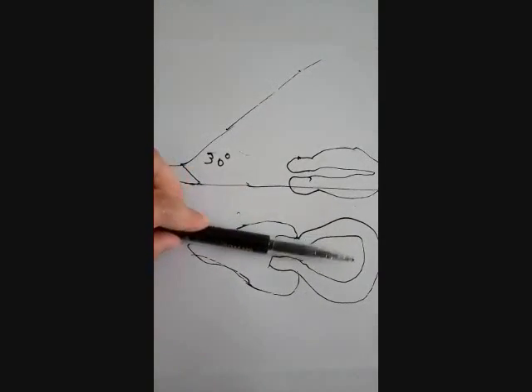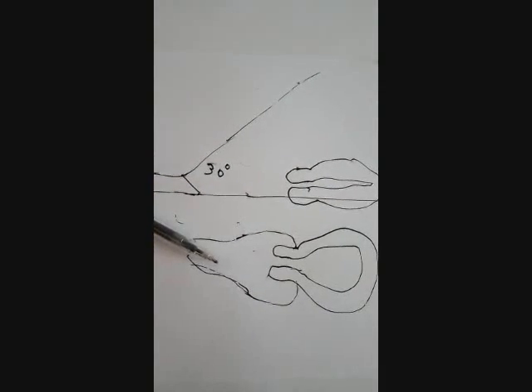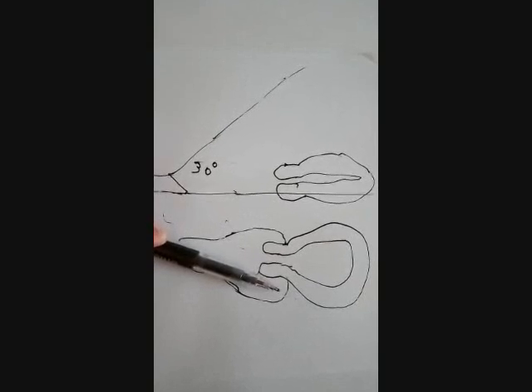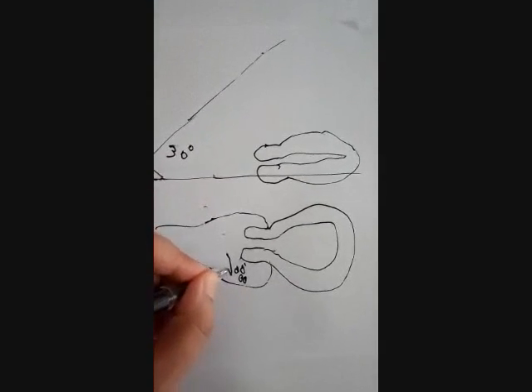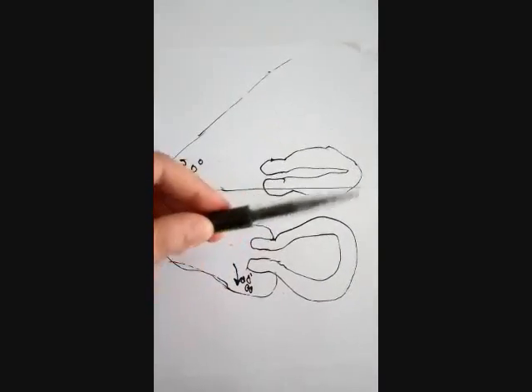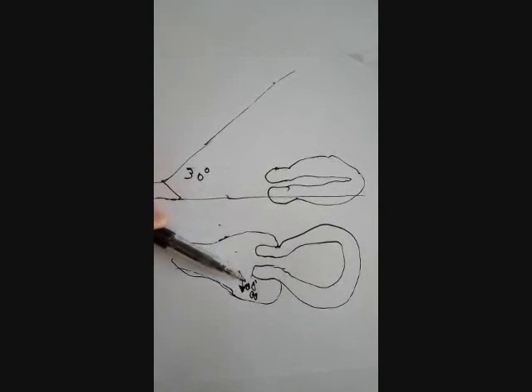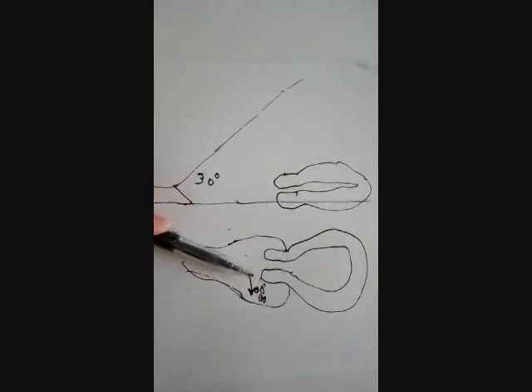This is the scope. For example, we insert it and advance slowly along the rear vaginal wall until we reach the fornix. And then we fill it with saline. When we insert the scope, we are letting the saline out. The saline is flowing. And once we get to the fornix, we fill it with saline so that it makes the cervix easier to locate.